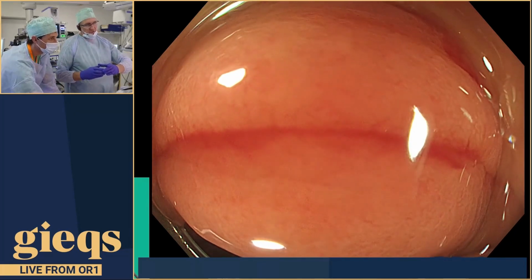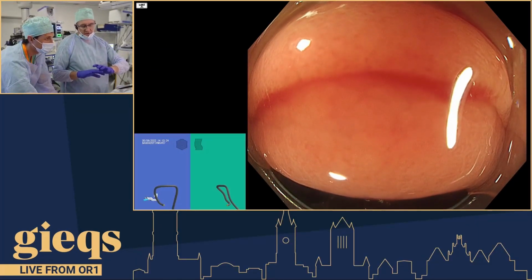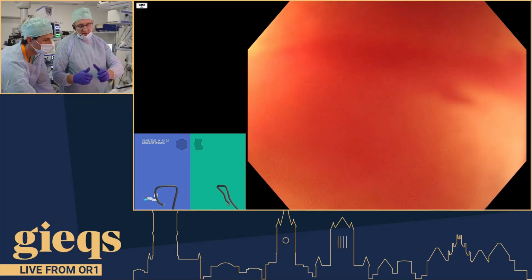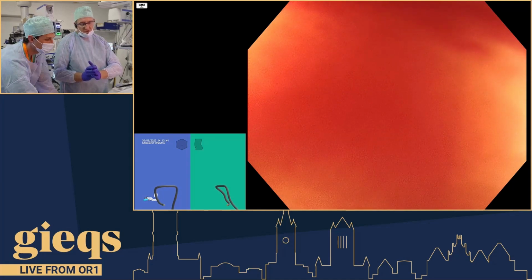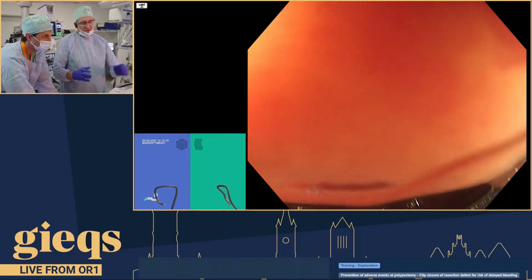a lot of pressure goes into the right colon, and if you have a mucosal defect with vulnerable vessels that are sublethally injured, then at some point with the stretching they'll bleed. So if you can just cinch it together a bit, it's going to be much better than, of course, if you can close it totally, that's perfect. But a lot of these big defects you can't close totally. So the best thing is to try and cinch it together, and that will reduce the shearing forces and expansile tension on the post-EMR mucosal defect.